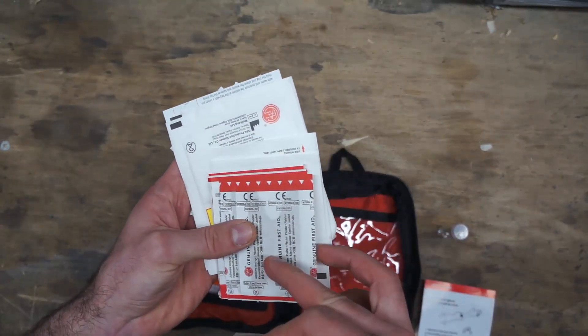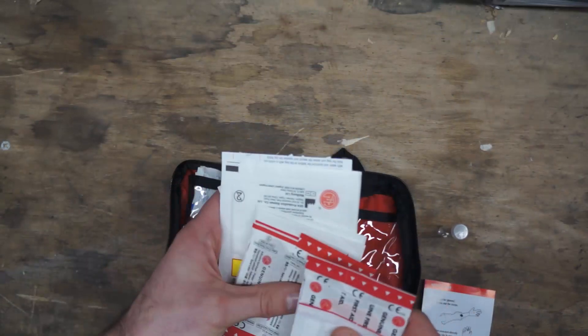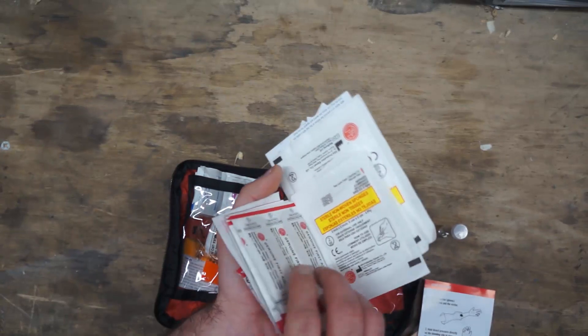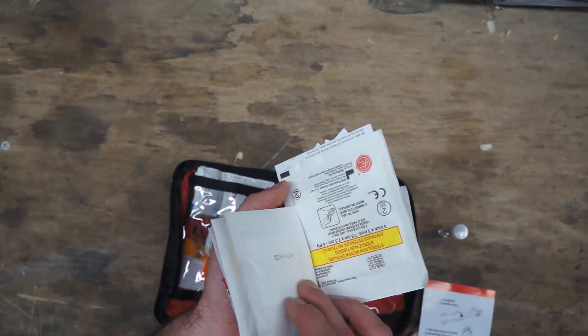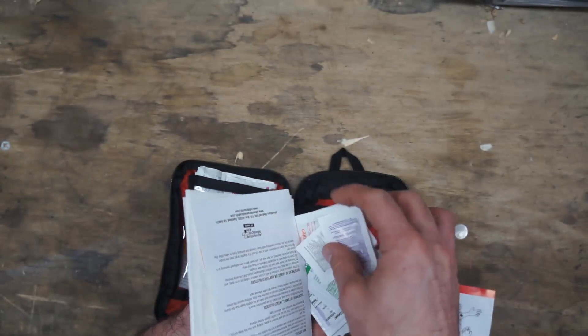There are some butterfly closures, large band-aids, smaller band-aids — a few different types and styles. Just a full little selection. There are also a couple of different sizes of gauze: a couple of the two-by-twos and a couple of the three-by-threes.